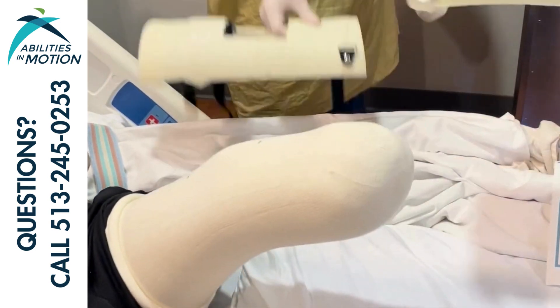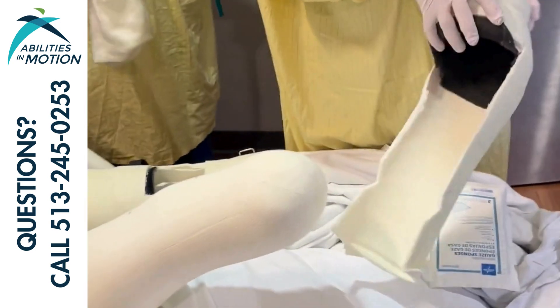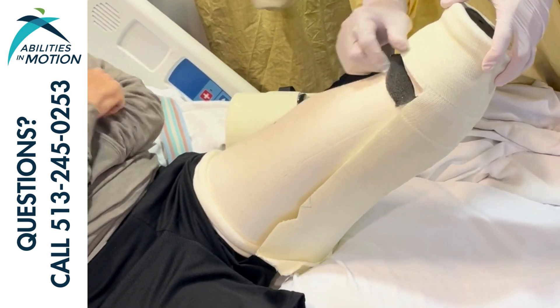Have the patient hold their limb up high in the air, knee straight. Tom's showing you the base of the cast. You want to make sure the very end point of the patient's limb makes contact with the base of the cast.